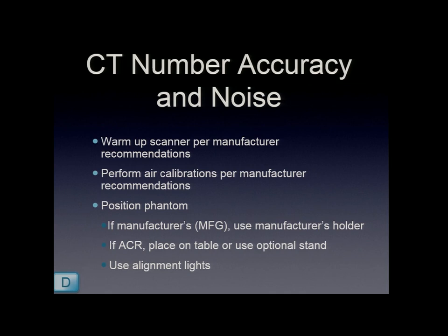And then most of them have these air calibration procedures that they require to be done daily before they go. And so they need to be done. And then they go in and position the phantom. A lot of them, if they don't have routine cases throughout the night, will actually position the phantom the night before, and so it's ready for whatever technologist is in there. So that kind of helps speed things up.